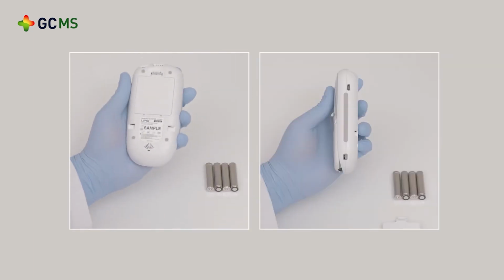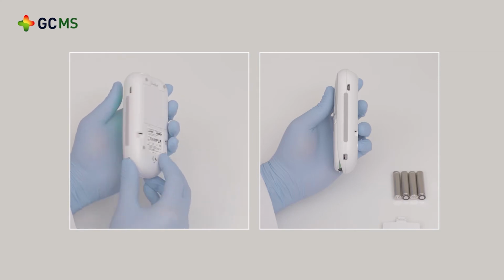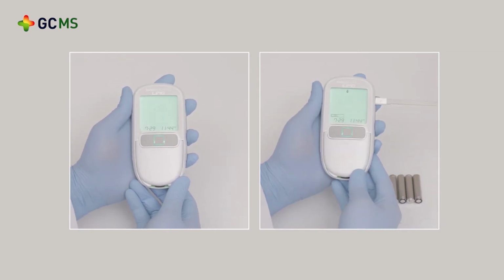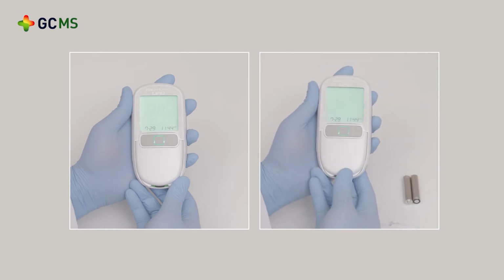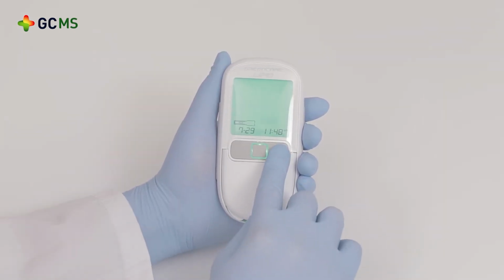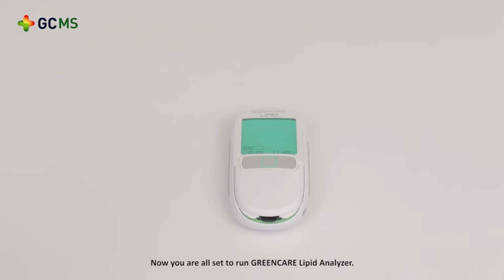Operating GreenCare Lipid Analyzer. To turn on the GreenCare Lipid Analyzer, either insert the AAA batteries or connect the USB cable to the analyzer. You can also operate the analyzer with 2 AAA batteries. Then turn on the analyzer by pressing the power button. The GreenCare Lipid Analyzer starts a self-check of the sensor after you press the right button for 10 seconds. You then see OK appear on the analyzer display. Now you are all set to run the GreenCare Lipid Analyzer.